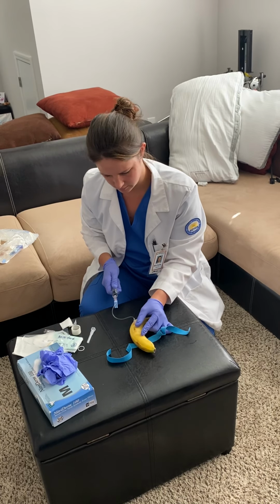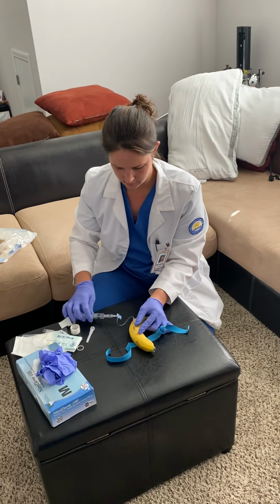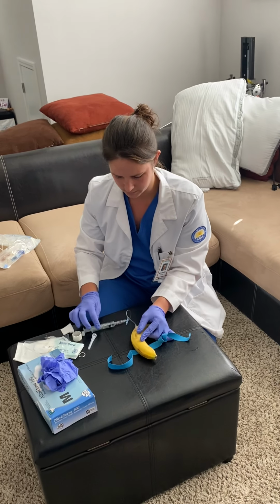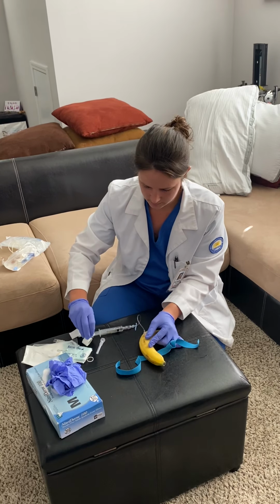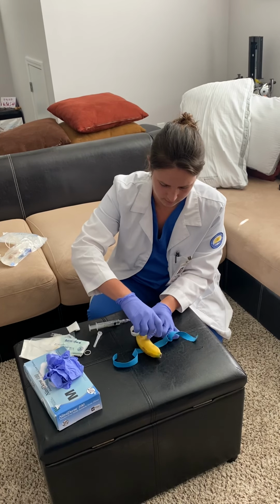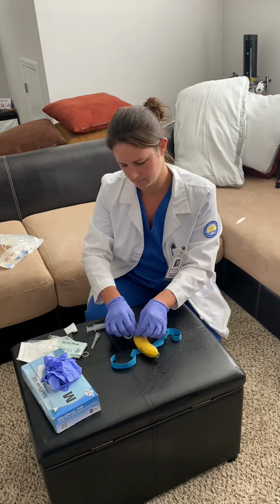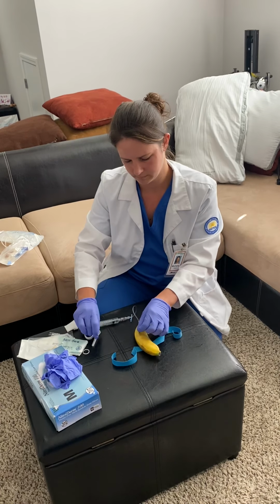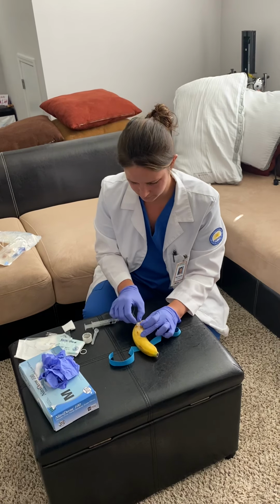And there it is. Good. You're going to go ahead and flush, and the vein is patent, so we know we have a good placement. I'm going to take my tape here and anchor the catheter. Putting pressure above.